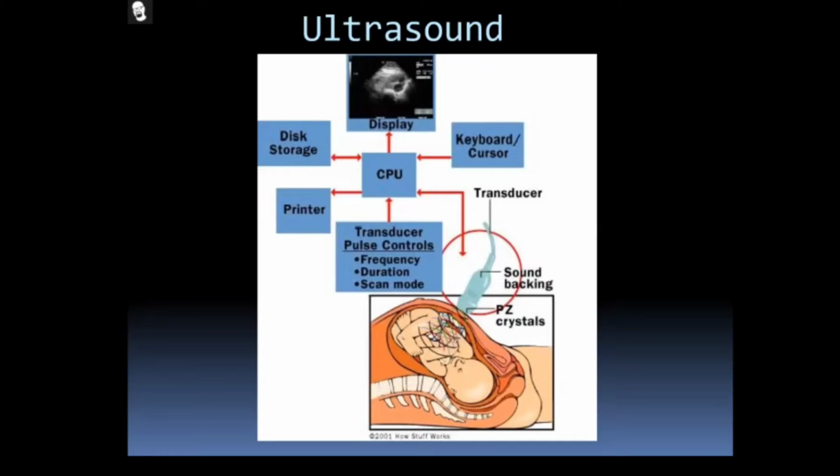Apart from that, the probe acts as a transducer. The probe receives the image and sends it to all the other computerized parts.